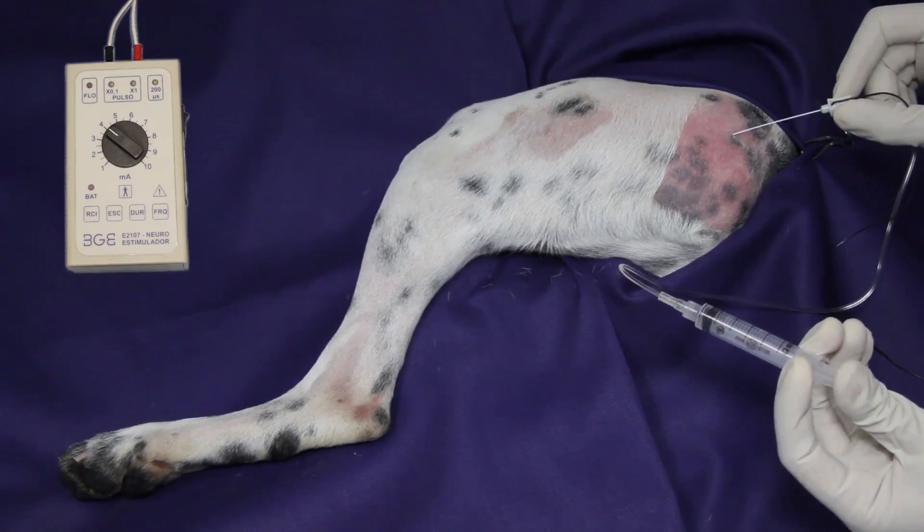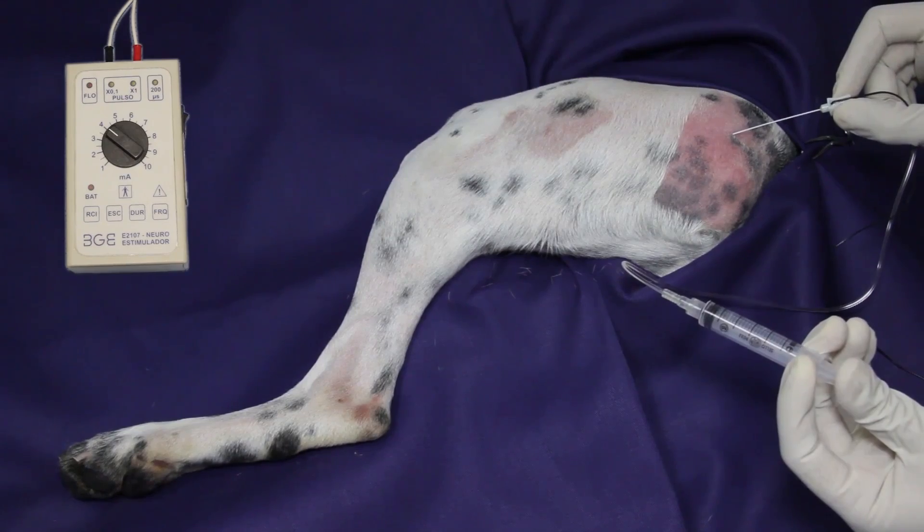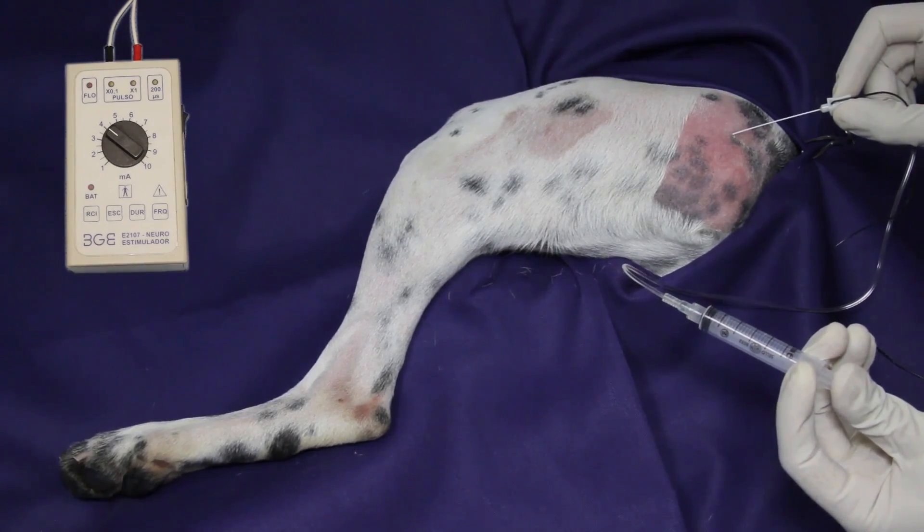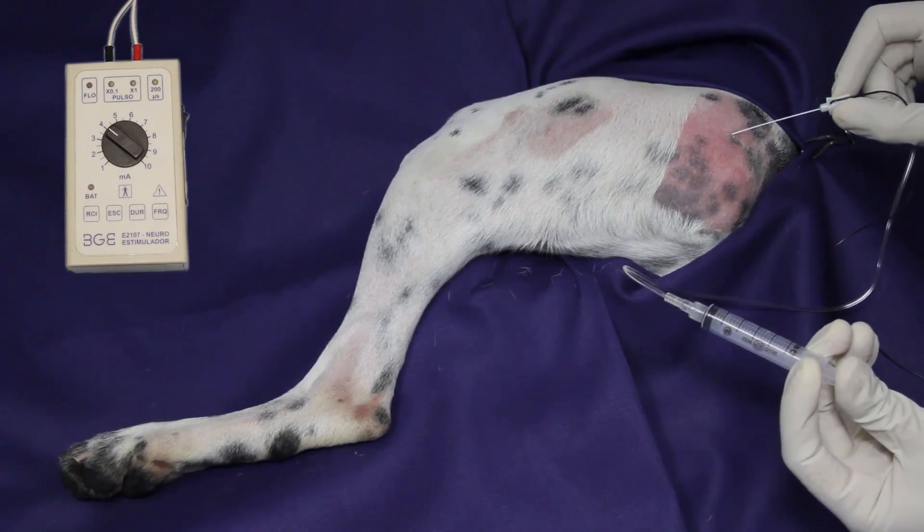When used in combination with the femoral nerve block, anesthesia will be produced to the distal femur.